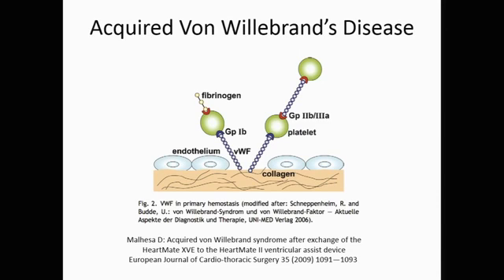These devices are basically blenders inserted into the circulation. All of your blood is passing by a rotor or a blender blade that's turning somewhere between 2,500 and 20,000 RPM. And as a consequence, it tends to slice and dice your red cells and everything else in your circulation. And one of the things that gets sliced and diced is the von Willebrand's factor.